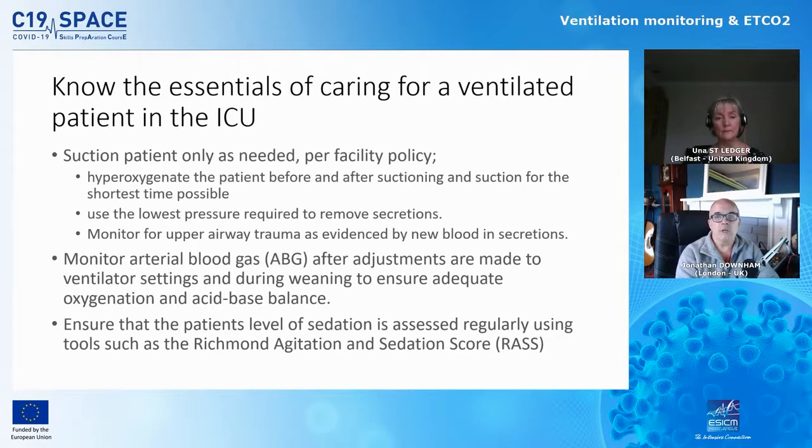Your suction machines will have a dial on them where you can set the pressures, and the hospital you work at will probably have policies for that as well. And once you've suctioned them, you need to be aware of the secretions that you're bringing up. So you might be asked, are they yellow? Are they green? Have they changed?